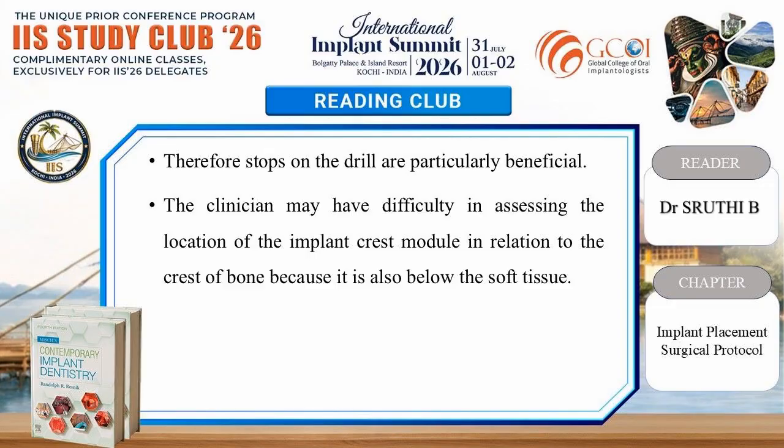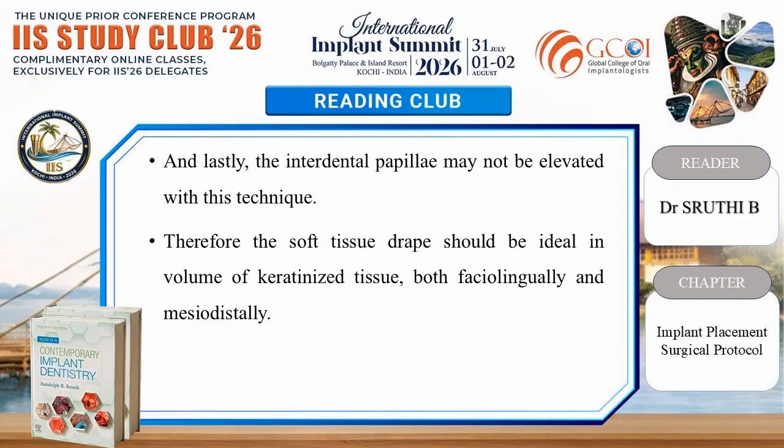The clinician may have difficulty in assessing the location of the implant crest module in relation to the crest of bone because it is also below the soft tissue. And lastly, the interdental papilla may not be elevated with this technique. Therefore, the soft tissue drape should be ideal in volume of keratinized tissue both facial-lingually and mesiodistally.